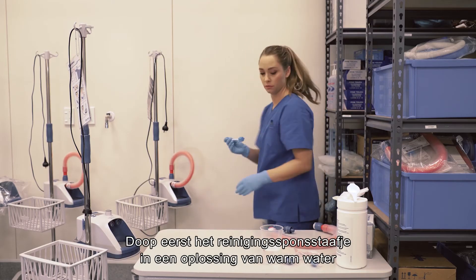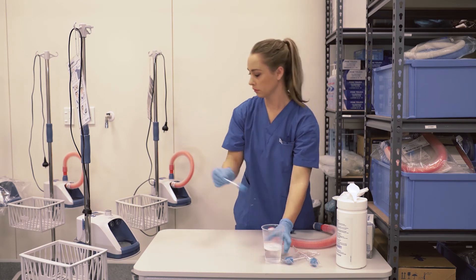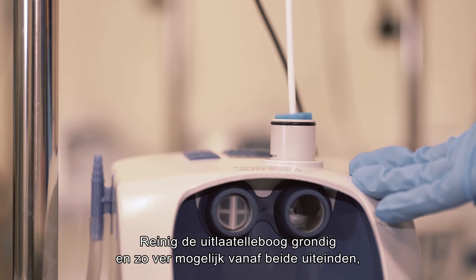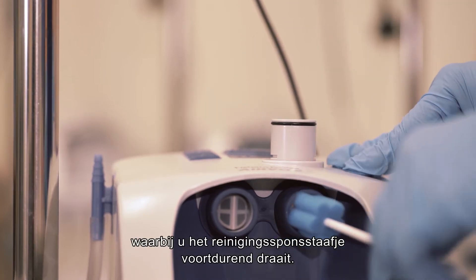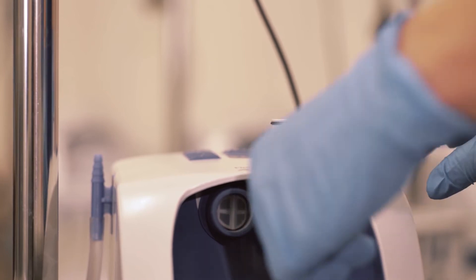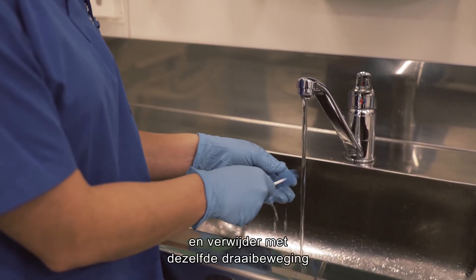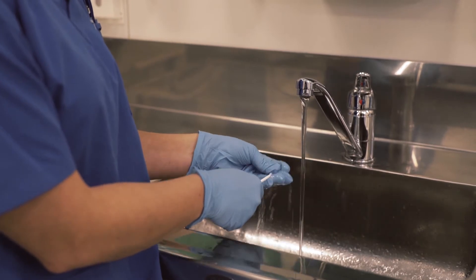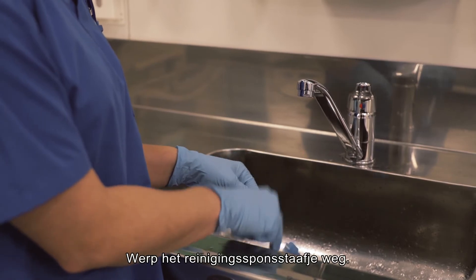First, dip the cleaning sponge stick in a solution of warm water and mild detergent. Thoroughly clean the outlet elbow from both ends as far as possible, continuously rotating the sponge stick. Rinse the cleaning sponge stick under running water and, using the same rotation action, remove any residue from the outlet elbow. Discard the cleaning sponge stick.